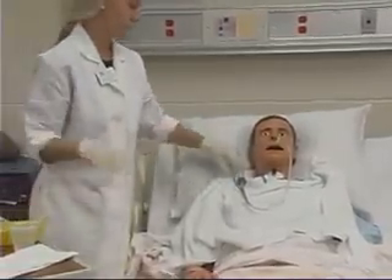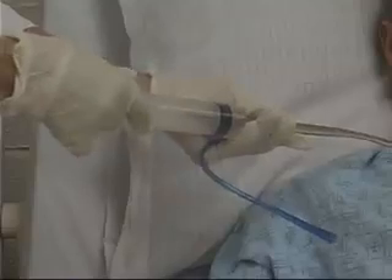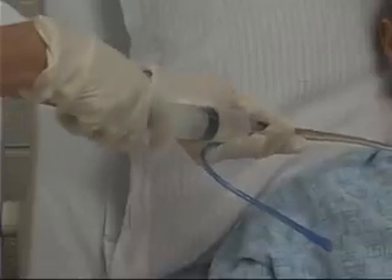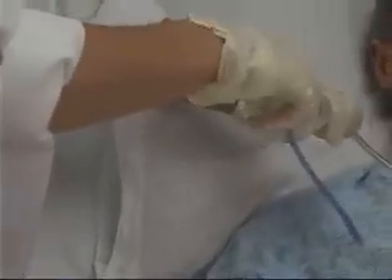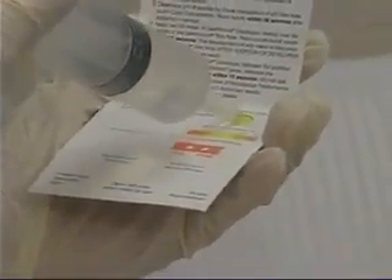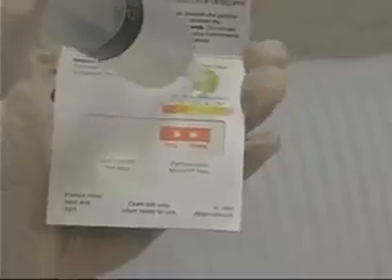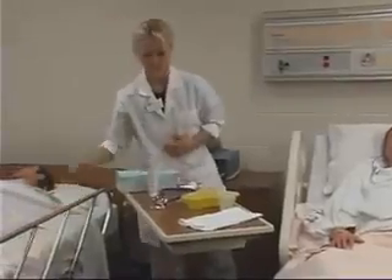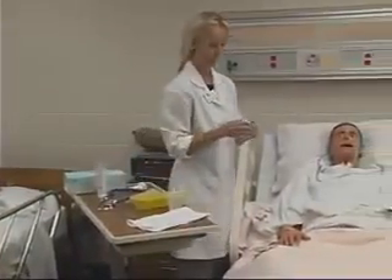Keeping the syringe attached, pull back on the plunger to aspirate gastric contents. Check for color and pH of the contents. Since secretions may be obtained from a tube inadvertently placed in the client's airway or pleural space, pH testing of aspirated secretions helps determine where the tube has been placed.